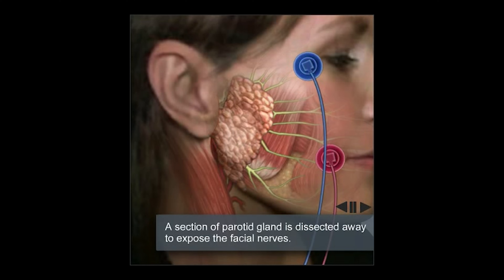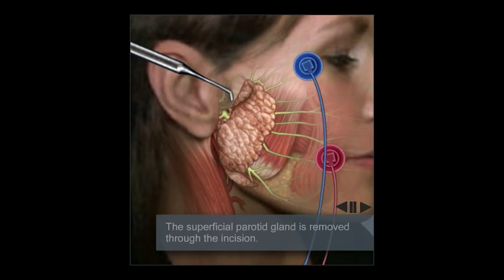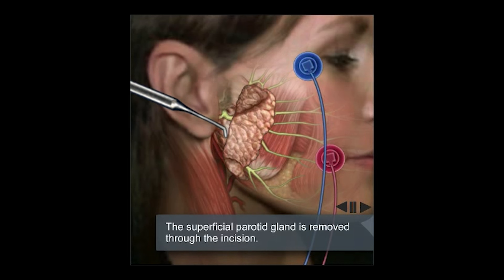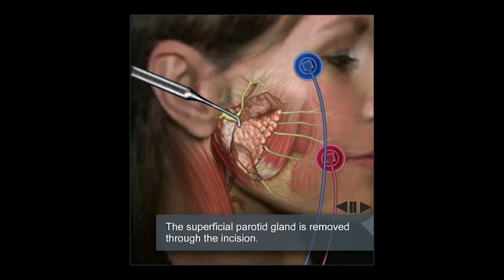A deep lobe parotidectomy has two parts to it. The first part is to actually remove the superficial lobe of the gland. Here you see the magic wand come in and identify the main trunk of the facial nerve. We stimulate it to confirm identification, and then proceed with moving the superficial parotid lobe out of the way and off of the branches of the underlying facial nerve.